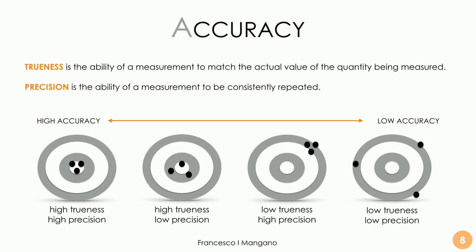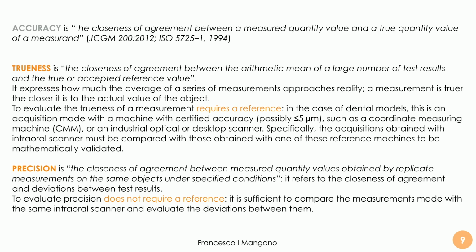Obviously, what we want to achieve is high accuracy, because with high accuracy we can really trust our model and we can use our model for clinical purposes very well. So the point is to have high trueness and high precision at the same time. It's key in order to work well with an intraoral scanner.